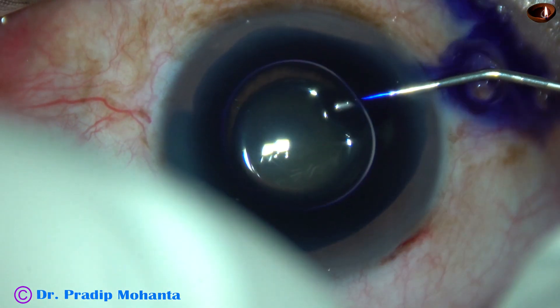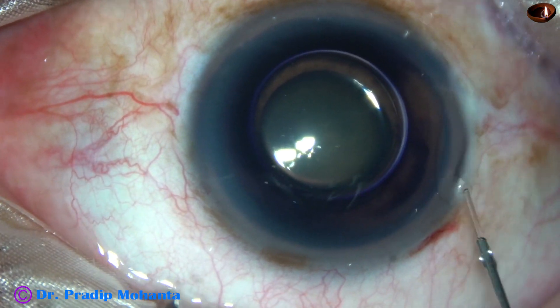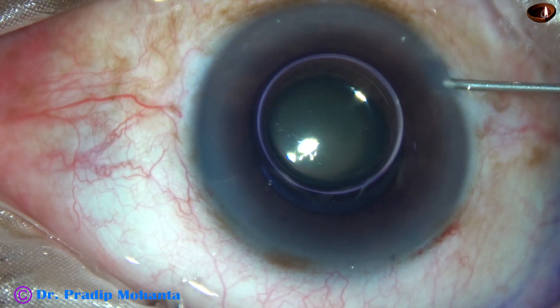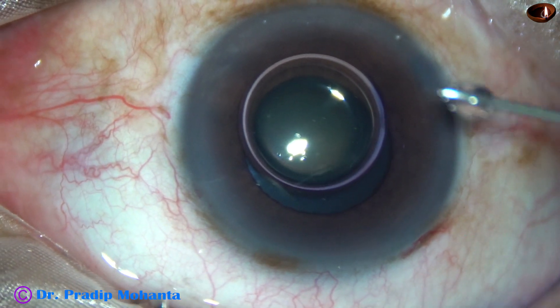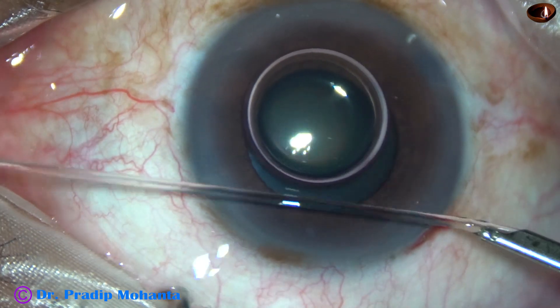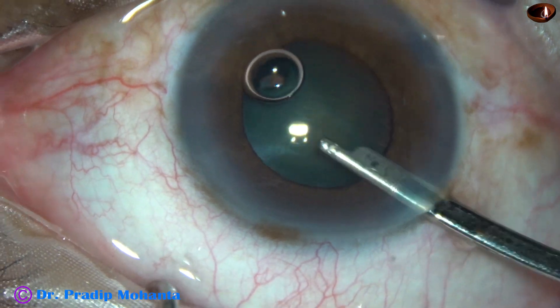So, after making the incisions, I am going to stain the anterior capsule with trypan blue dye. Now, this is adrenaline. After injecting adrenaline, I am waiting for a few seconds to see if the pupil dilates to some extent. But in this case, the dilatation of the pupil is not dramatic.